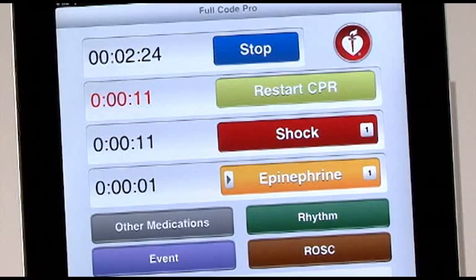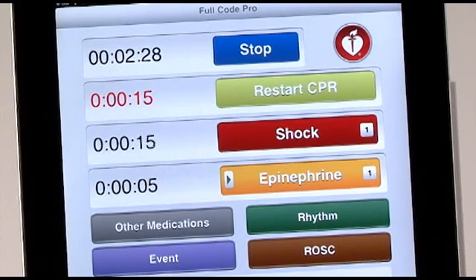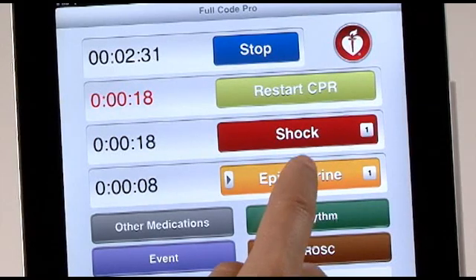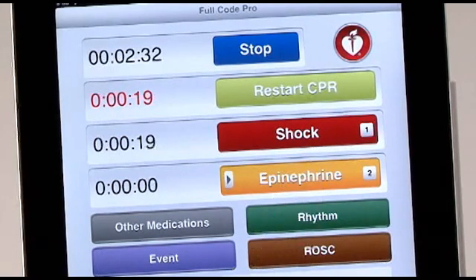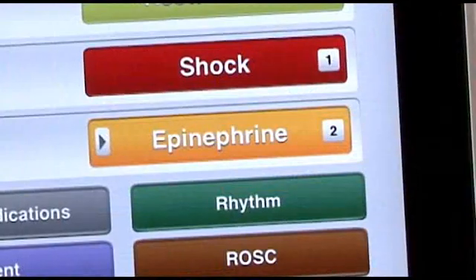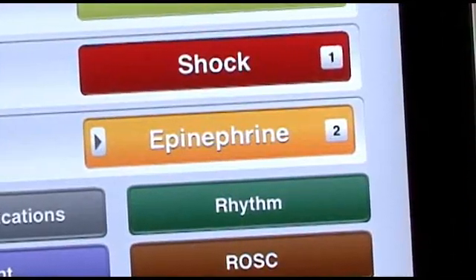Selecting the yellow Epinephrine button will start the Epinephrine timer. When you touch this button again, the timer restarts. The number of times that Epinephrine has been administered is shown on the far right of the button.